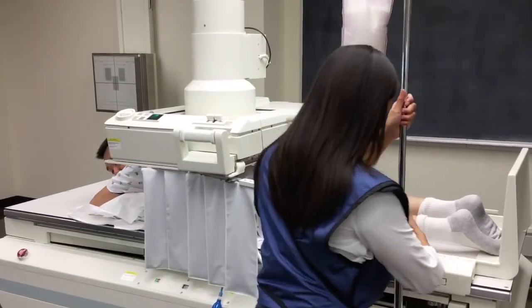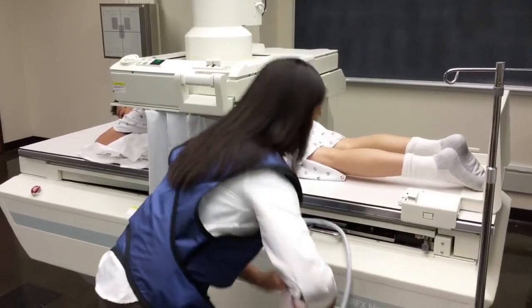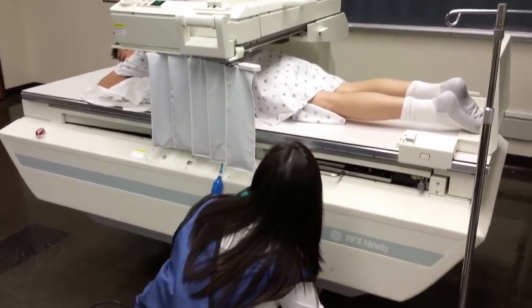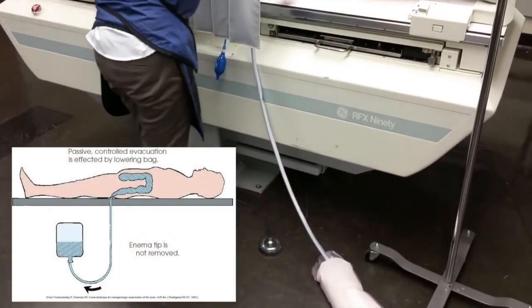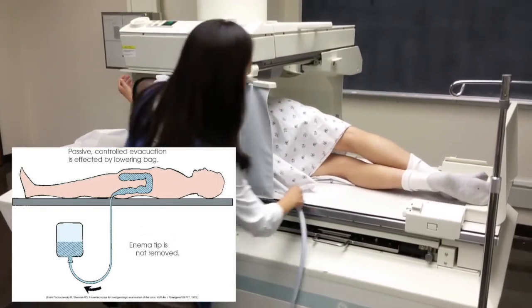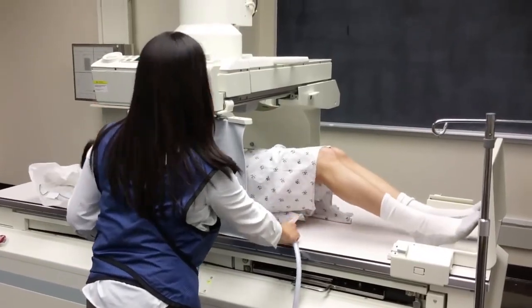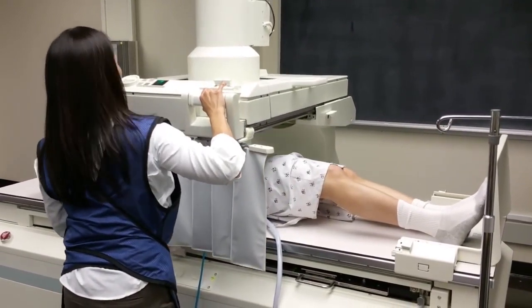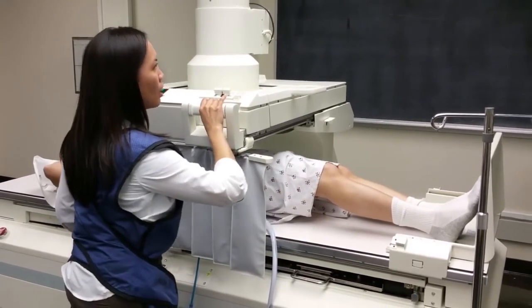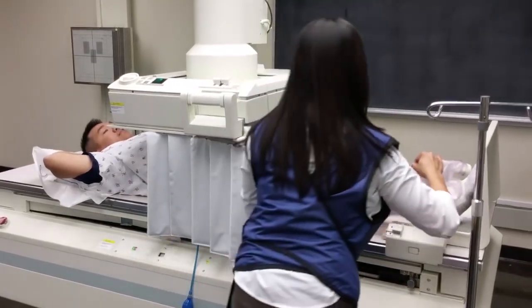Once barium reaches the middle of the transverse colon, the enema bag is gently lowered to the floor and the rectum is drained by gravity. Make sure you don't clear the entire rectosigmoid colon of barium, because we need enough barium within the colon to coat the entire mucosa and also fill the ascending colon. The small amount is cleared from the rectum to make sure there aren't pools of barium that might obscure lesions.